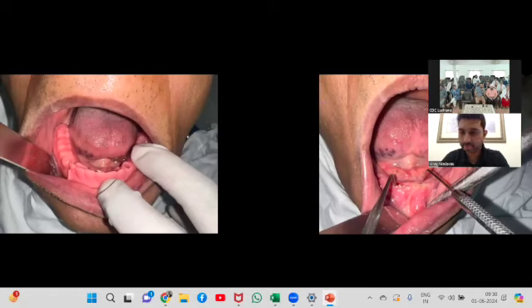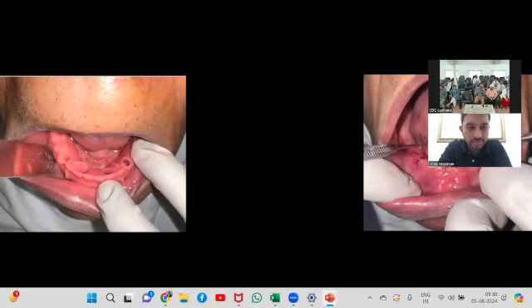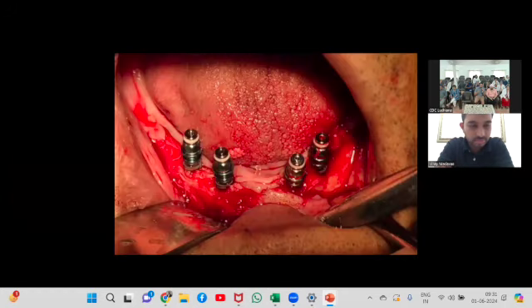These are pictures courtesy of the surgery team. Surgery was performed by Dr. Indrajot sir, and they used it handheld. Something we can learn from, some way to stabilize it better. Yes, we can; someday we'll soon get there. We used the position over there. He used his pilot drills through the holes that I gave him, because we wanted the implant position right there, and he used the pilot drills to fix the implant positions.